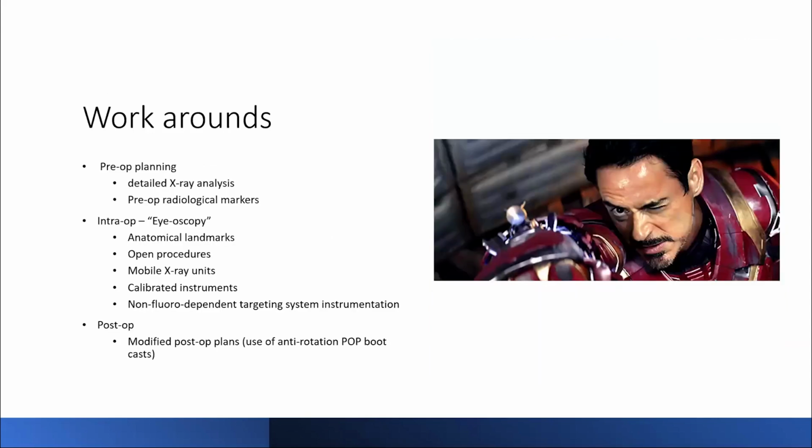So the workarounds, I kind of group into 3 time frames. So things that you can do pre-operatively, then the intraoperative modifications, and then the post-operative things to do.